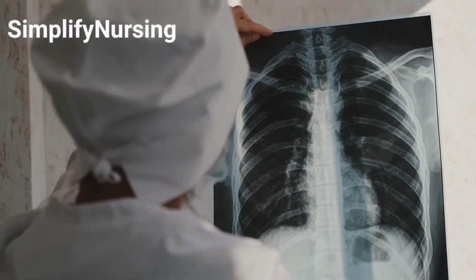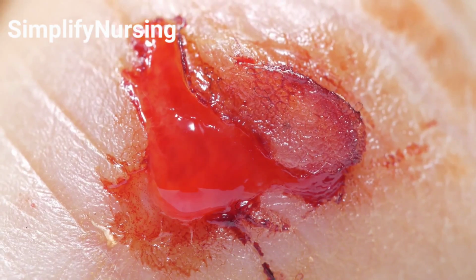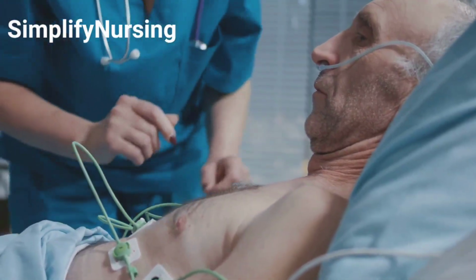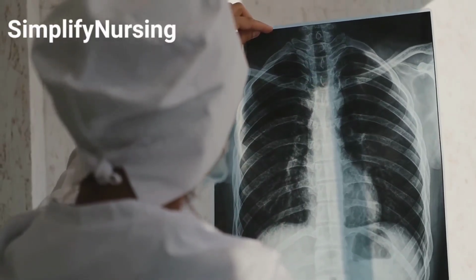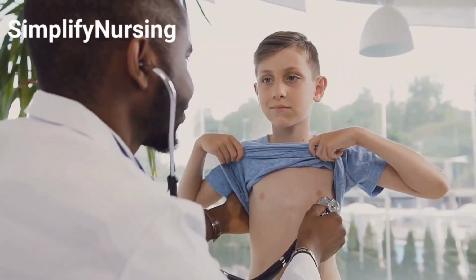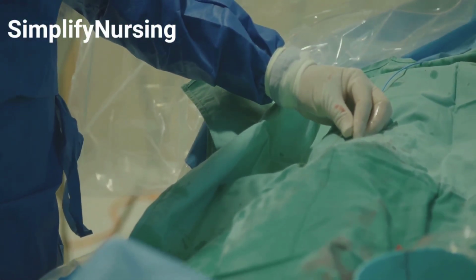Now, let's talk about some potential complications you need to be aware of. First, infection. There's always a risk at the insertion site, so you need to monitor for any signs of redness, swelling, or discharge. Next, pneumothorax. This can happen if the tube is not positioned correctly or becomes dislodged. Then there's subcutaneous emphysema. This occurs when air leaks into the subcutaneous tissue, and you might feel a crepitant sensation. Another potential issue is re-expansion pulmonary edema. This can occur if the lung is re-expanded too quickly. Lastly, tube dislodgement. This can lead to a pneumothorax and requires immediate action.